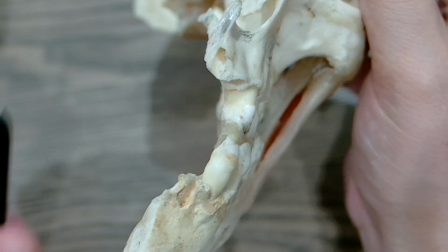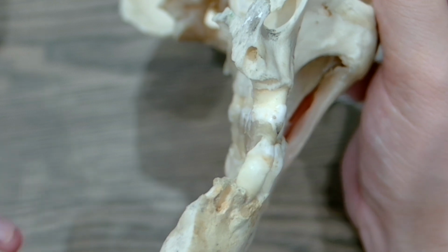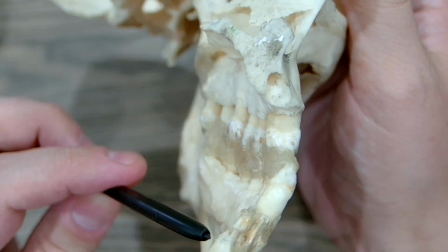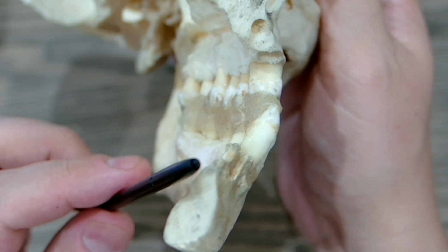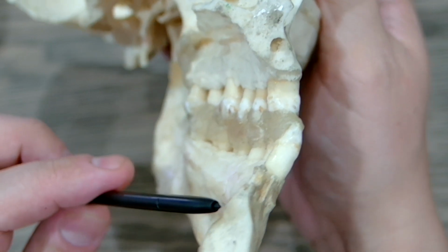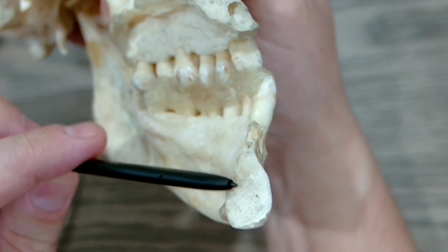You can use a spoon excavator, elevator, whatever you use, but reflect that tissue on the lingual to at least your anticipated depth, because the bone tends to be very thin to begin with here.